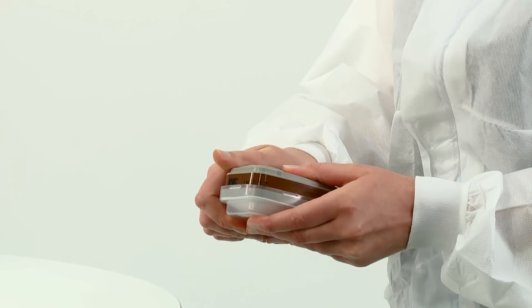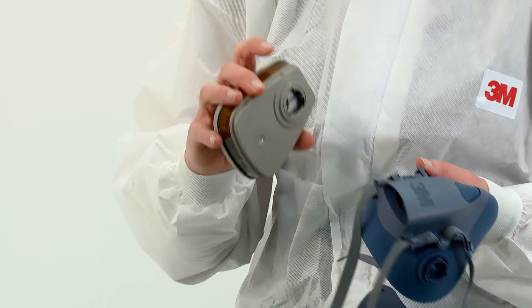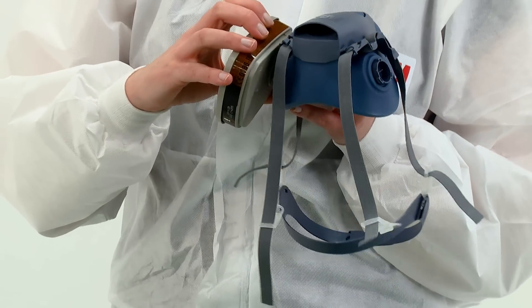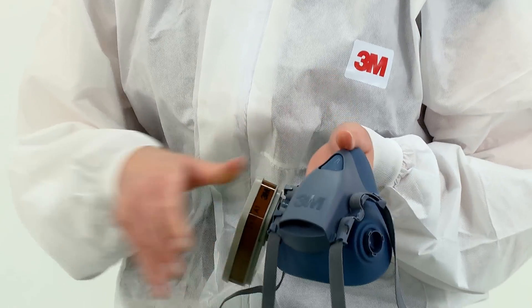To fit gas and vapor filters or combination filters, align the lines on the inside of the filter to the arrow on the mask and secure in place with a quarter turn clockwise. Remember to always replace filters as a pair.